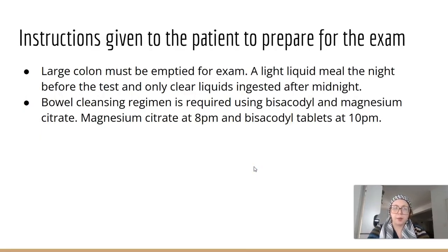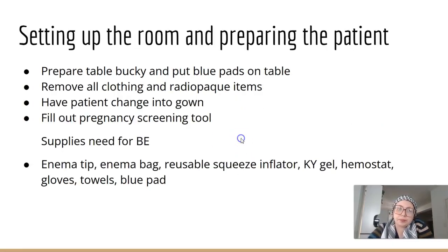Before the exam, we want our patient to know how to prepare for 24 hours before the exam. The large colon must be emptied for this exam. So a light liquid meal the night before and only clear liquids ingested after midnight. We want to give them a bowel cleansing regimen. We are going to use two different types of laxatives: magnesium citrate at 8 p.m. and the tablets at 10 p.m.